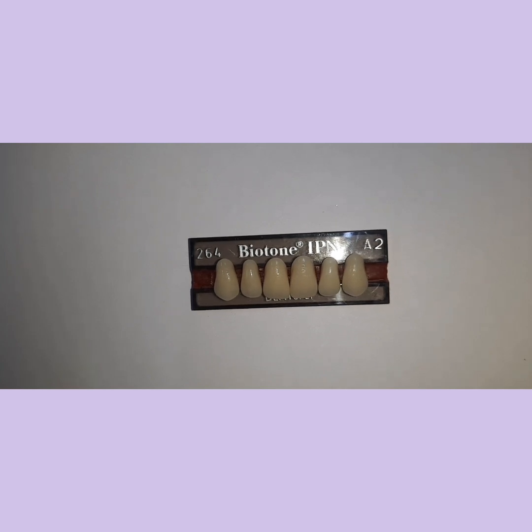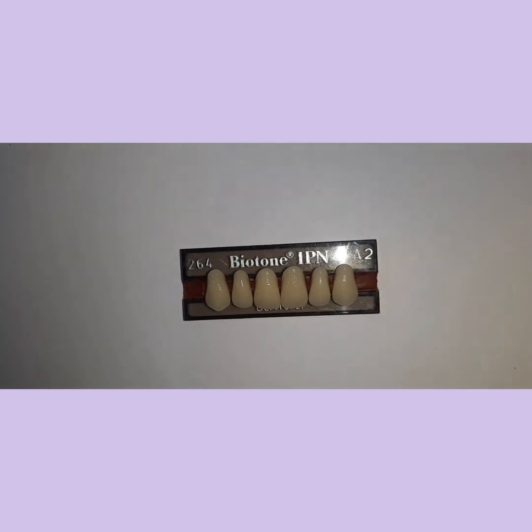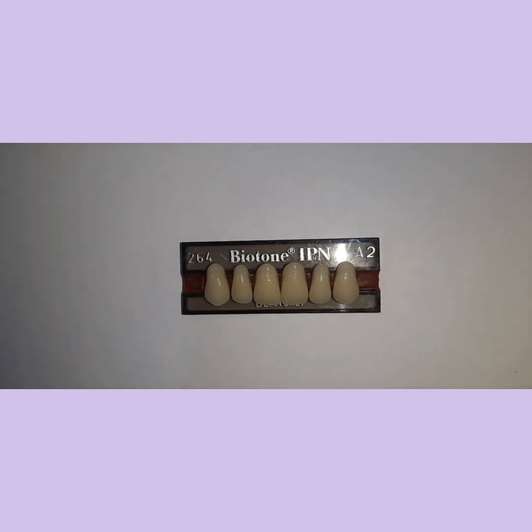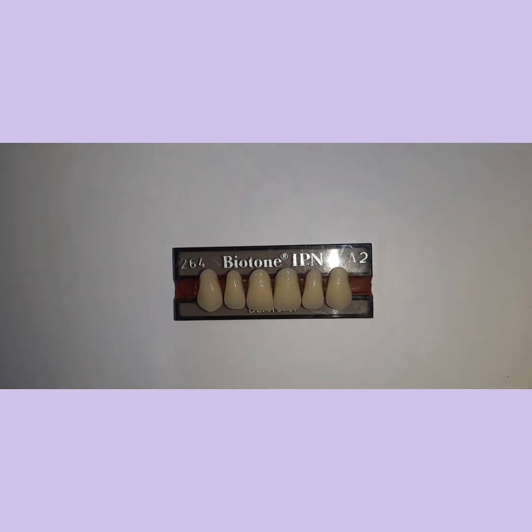The factors influencing shade selection include age. Of course, in a very old adult, you cannot have very light teeth. That will look odd for that particular patient and their personality. So you have to choose accordingly. The color of the face is also one of the criteria. The color of the skin and the color of the hair can also influence the selection of anterior teeth based on color.